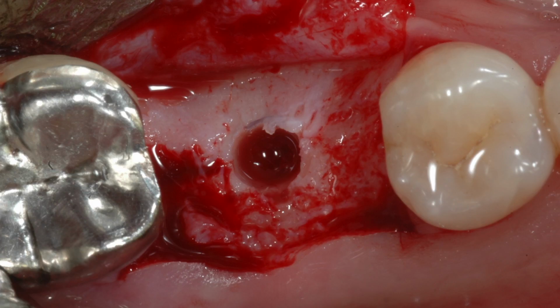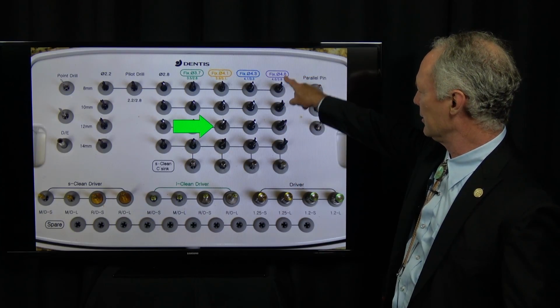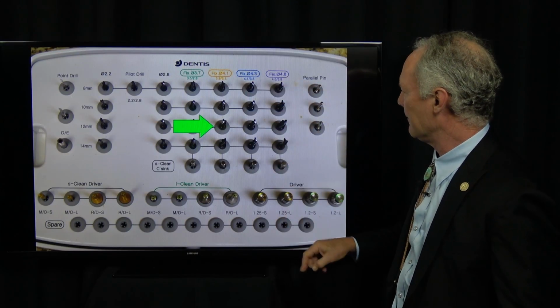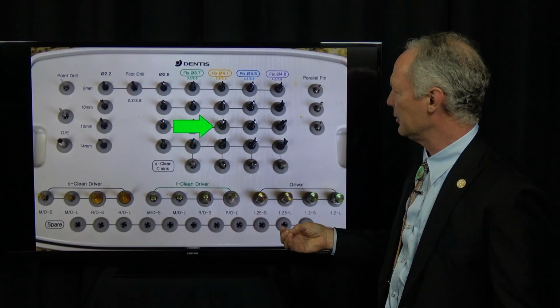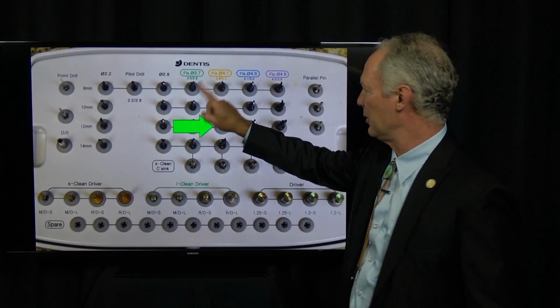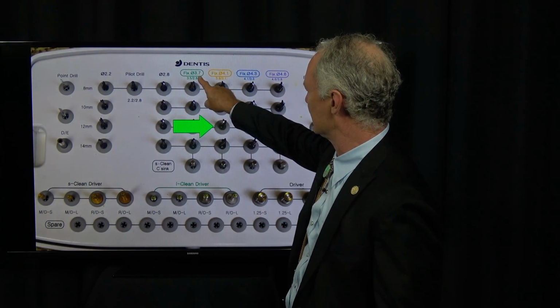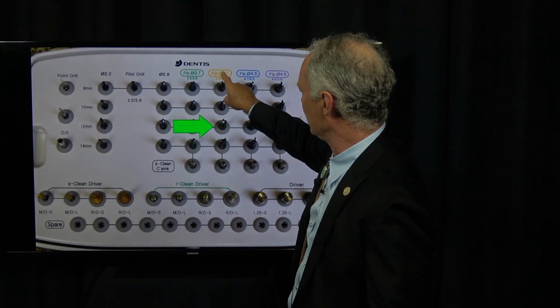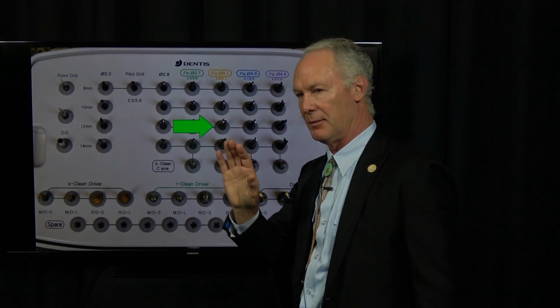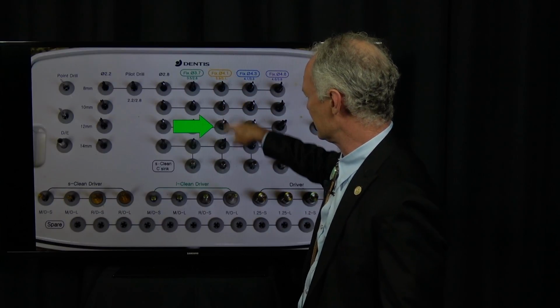So there's the osteotomy. Here's the implant. This tells you what you're going to use. If you get to this drill, you're going to use a 4.8. Now, in the maxilla, you're going to use a larger implant than drill. In other words, if you end up with this drill, you may use this implant because the bone is so soft. But in the mandible, you're going to use the same implant as the size of the drill.